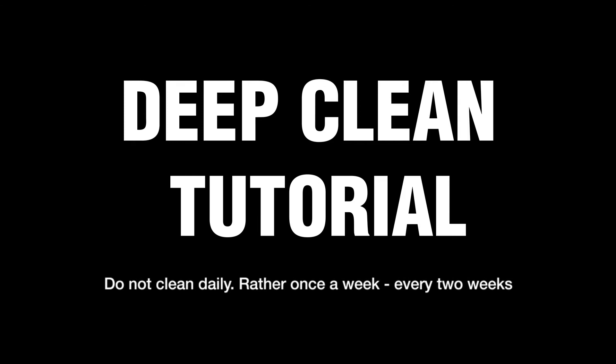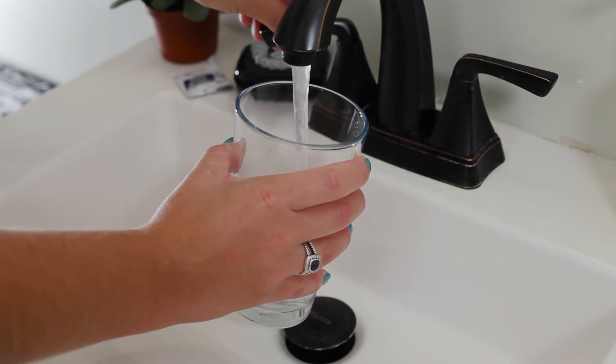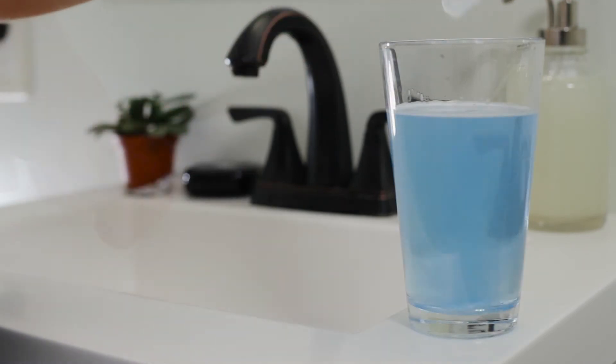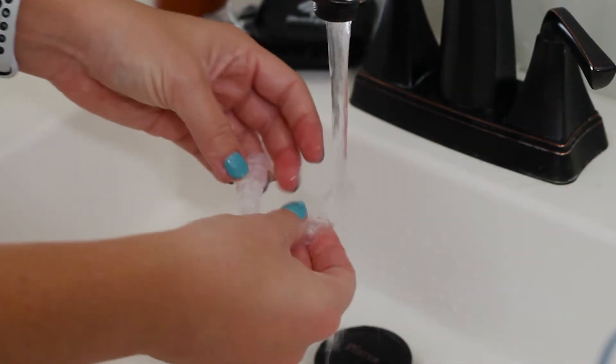For a deep clean, you can purchase a box of denture cleaning tablets for less than six dollars at your local drugstore. Fill a glass of water and drop a denture cleaning tablet in. Allow the mouth guard to sit for the recommended time. Rinse thoroughly and pat dry.